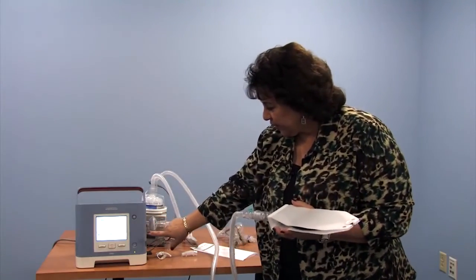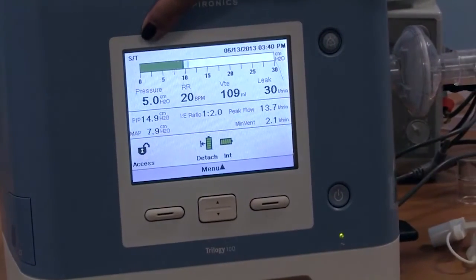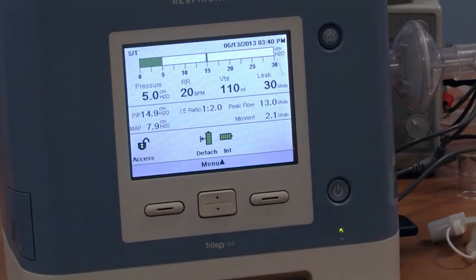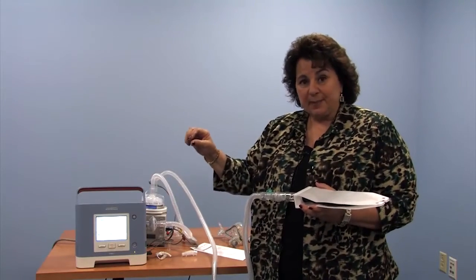Over here, what you'll see on the machine is that it now says ST. The mode is up in the upper left-hand corner. ST stands for spontaneous timed. That is a type of BiPAP setting.